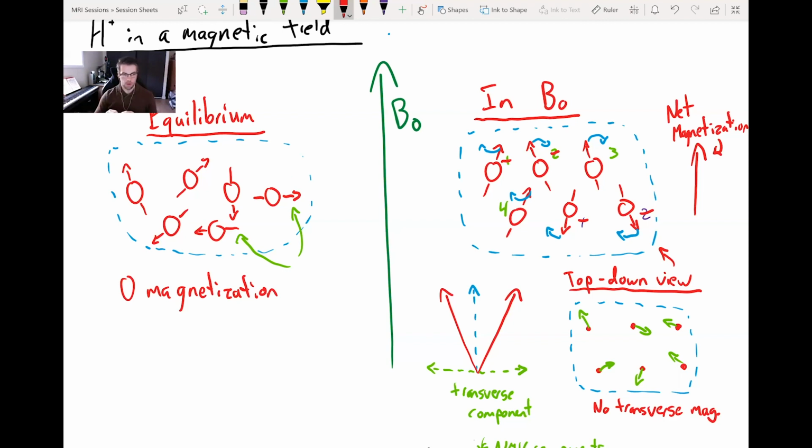There is one other important thing to touch on here, and that is the only equation that we are going to bring up in this whole lecture series. It is short and it is very important, so this is why we're including it. And that is the equation for the precession frequency of these atoms, right? Because they're all spinning, they're all precessing like that wobbling top. And it turns out we know what frequency they are spinning at. So let me just draw it above. Hopefully this doesn't get too crowded.